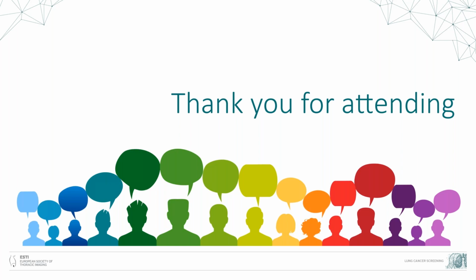Okay, I have received a question from Lisandro Paganini. Thank you very much. Do you use ACR Lung-RADS? ACR Lung-RADS has, I think, nothing to do with our technical standards, and the nodule management will be discussed in further webinars. So I don't want to go into detail, but I think the ACR Lung-RADS is mainly based, or was mainly based, on nodule size. And I think the ST definitely is going for volumetric assessment. But the nodule management systems will be discussed. I don't know, Ricarda, in which webinar, but there is definitely one about management of solid and management of subsolid nodules.